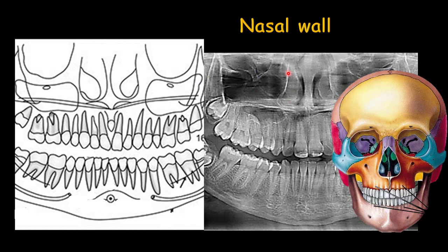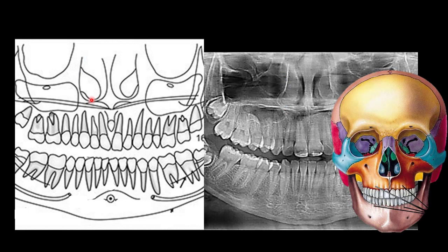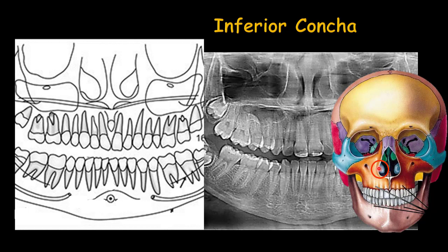The lateral wall of the nasal fossa is in contact with the medial wall of the maxillary sinus. The projections are called the middle concha and the inferior concha — you can see these in the skull. Mostly the inferior concha is seen in the panoramic radiograph, as shown in the schematic view and in this panoramic radiograph.